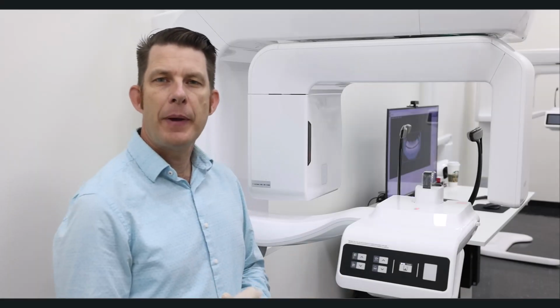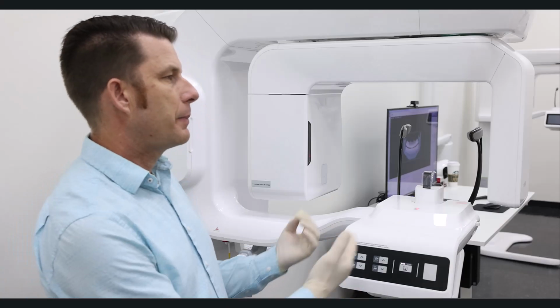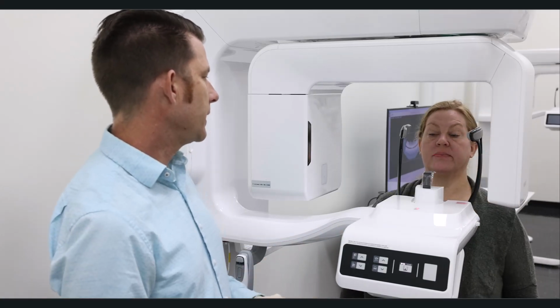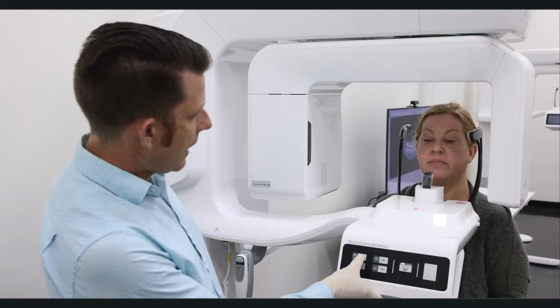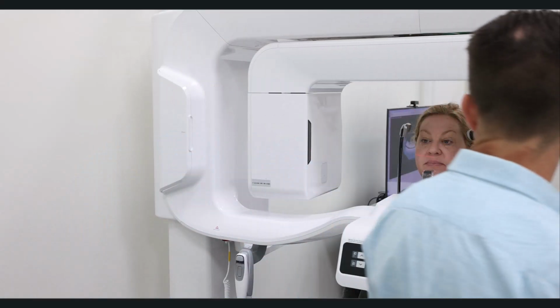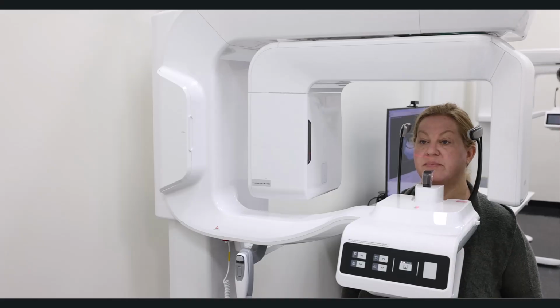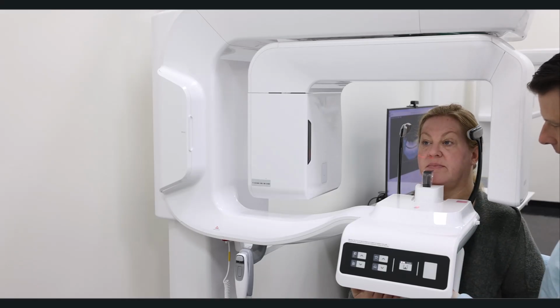Smart Plus 2D Panoramic Capture. First, I'm going to go ahead and bring my patient into the machine. Go ahead and stand up straight for me. And again, I'm going to get the chin rest just below her chin by moving the column up and down. And then I'm going to walk over here and we're going to do the same thing. We're going to start with our hands, our feet, and then bite on the bite stick. So go ahead and bring your hands up and palms facing up, feet shoulder length apart.